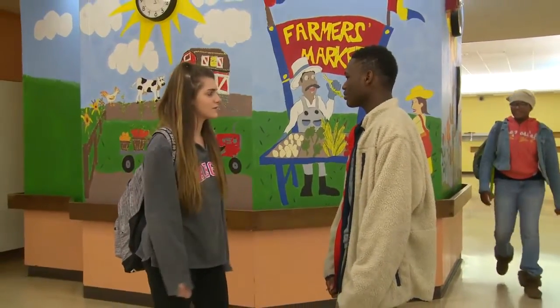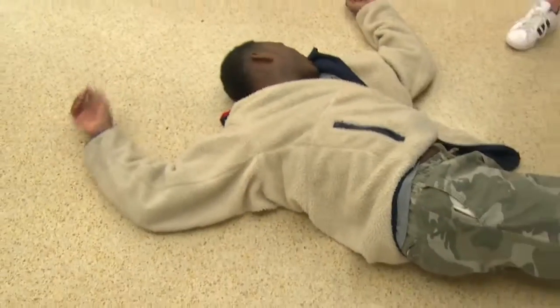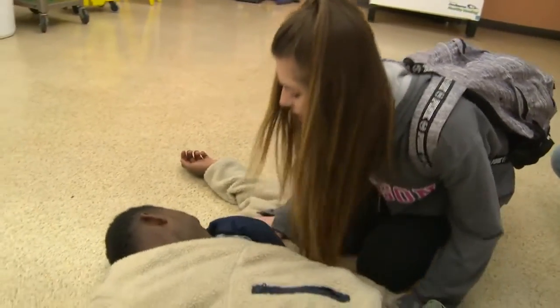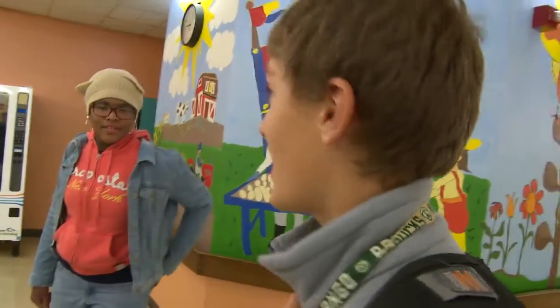I don't really want to be honest, but you want something from the vending machine? Are you okay? Davion, are you okay? Wake up! Get up! You call 911 and I'll get the AED.